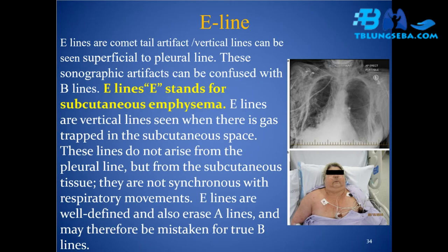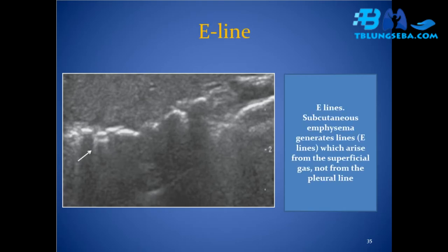E-line: E-lines are comet-tail artifacts / vertical lines seen superficial to the pleural line. These sonographic artifacts can be confused with B-lines. E stands for subcutaneous emphysema. E-lines are vertical lines seen when there is gas trapped in the subcutaneous space. They do not arise from the pleural line but from the subcutaneous tissue, are not synchronous with respiratory movements, and erase A-lines — and may therefore be mistaken for true B-lines.